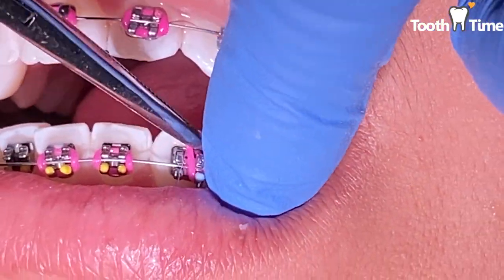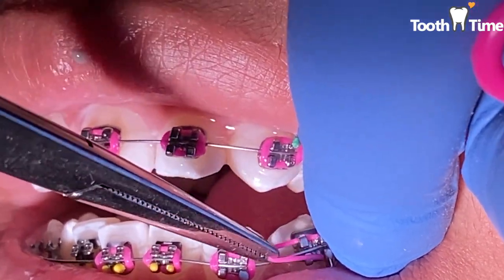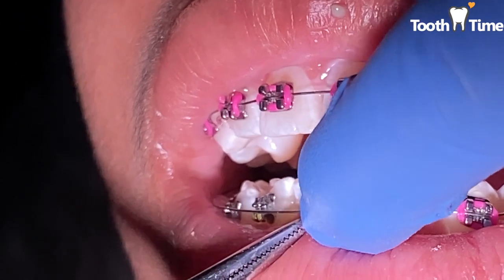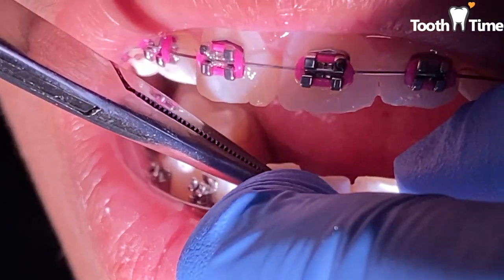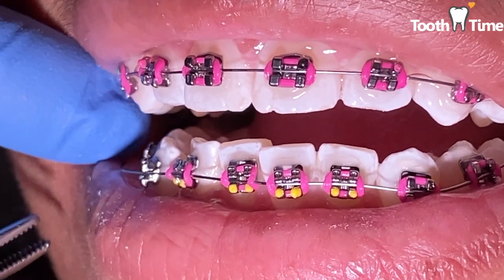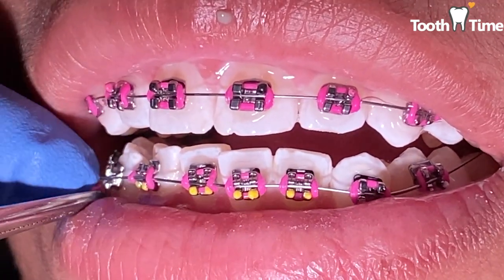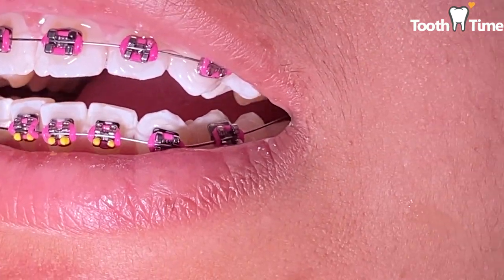Once the wire is placed and colors are on — she got hot pink — we're going to let the patient know how to use her wax and go over home care recommended products. You can click the link above to go straight to our storefront. If you don't use your tooth bristles you'll accumulate plaque and gingival inflammation, meaning red, bleeding gums. You also want to use your water pick, which is going to be your best friend during orthodontic treatment.